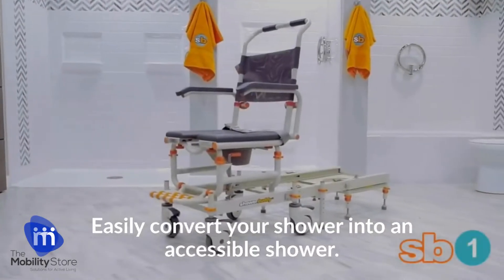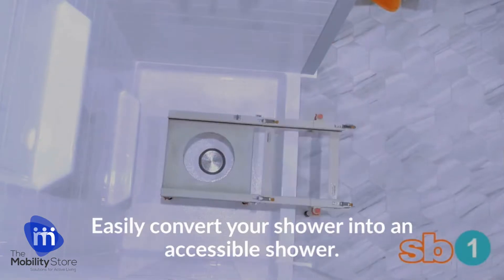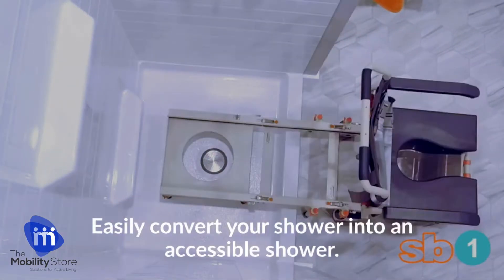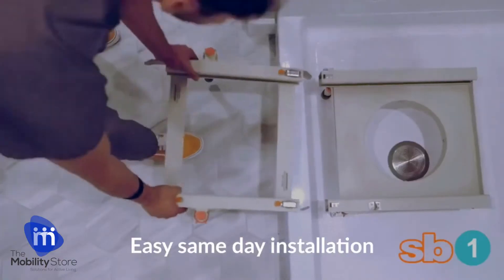The ShowerBuddy SB1 Shower Transfer System converts your step-in shower into an accessible shower without the cost of an expensive remodel. Tool-less installation in minutes, allowing you to bathe the same day.